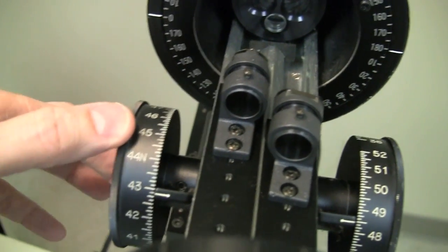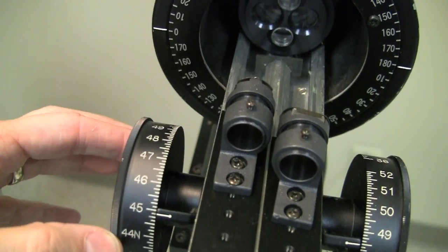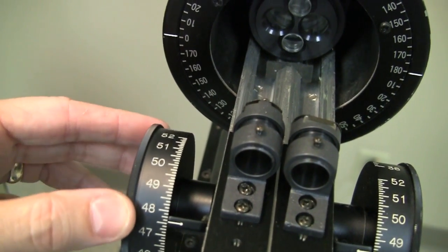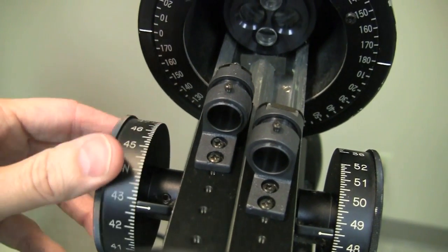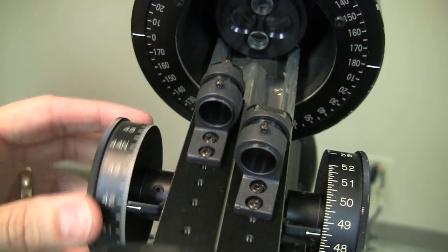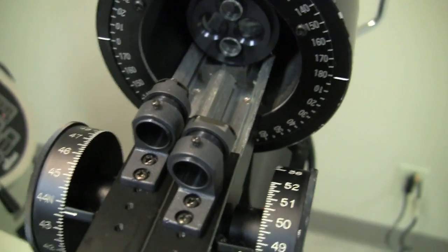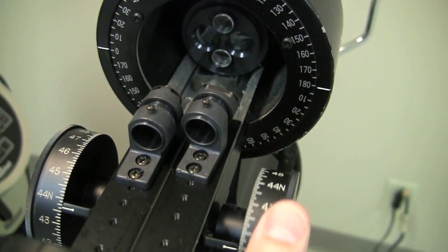Notice that the numbers go to higher and higher diopter values or shorter radius of curvature values as I move this towards me, and lower numbers as they go towards the patient. That won't make a whole lot of sense yet, but that's what happens. So if I move the vertical one, you can see this one is moving instead.